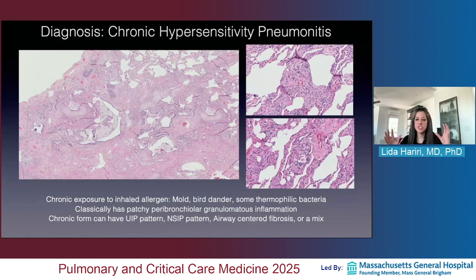histiocytes. Sometimes they're just aggregates of a couple of giant cells that are present together. They are not the tight, compact granulomas that you would see in a mycobacterial infection or a case of sarcoid. They're looser than that, subtler than that.